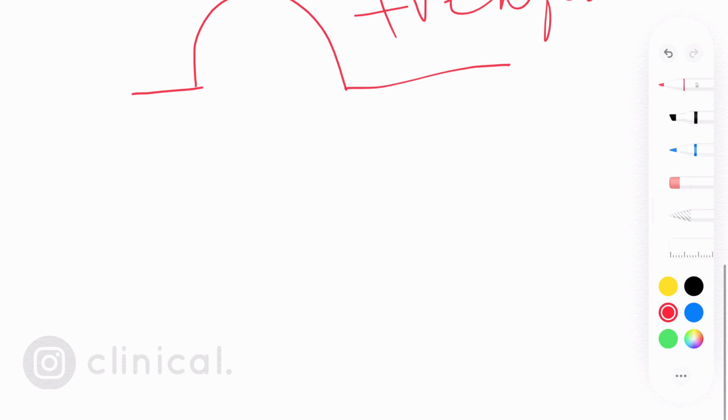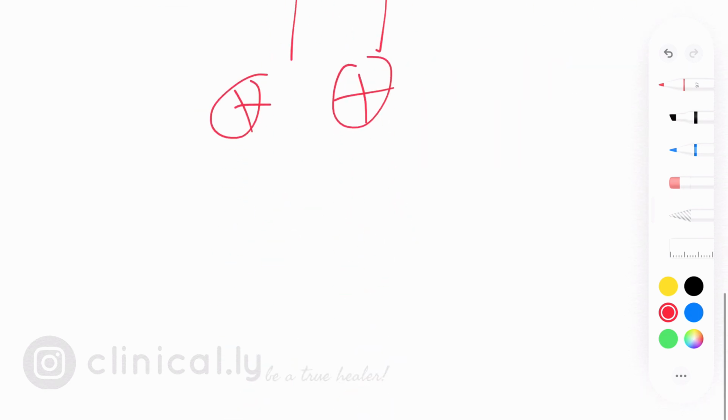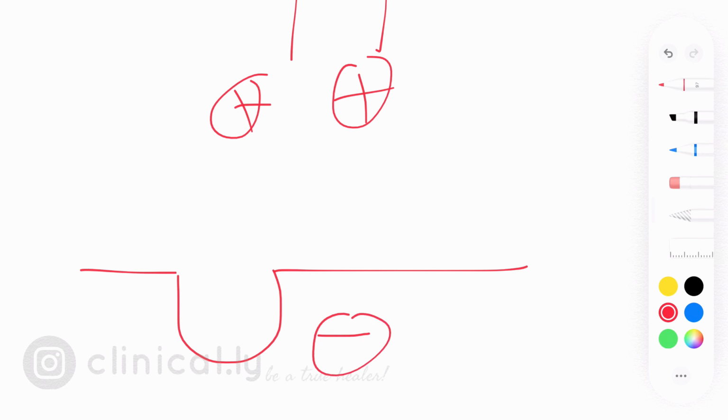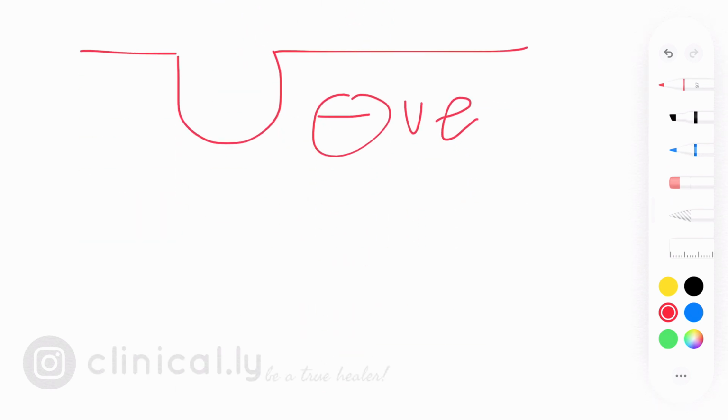And when the activity is going away from the recording electrode, it is plotted on the ECG below the baseline and it is called a negative deflection. Again, this is accepted universally, so everybody continues with the same convention and we will also use the same.